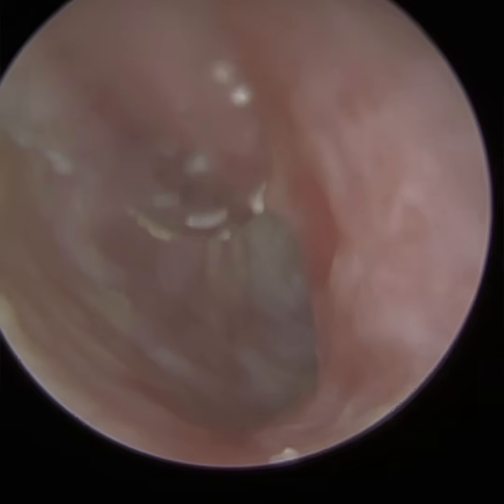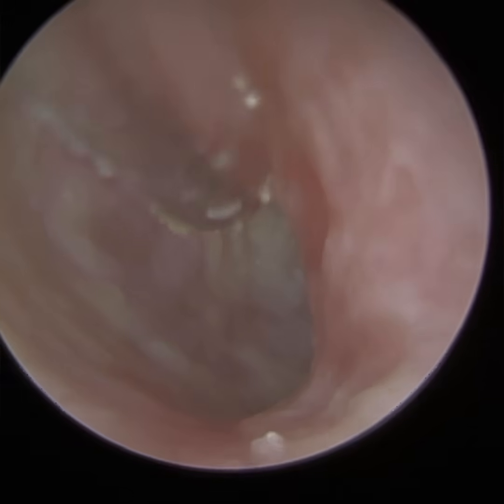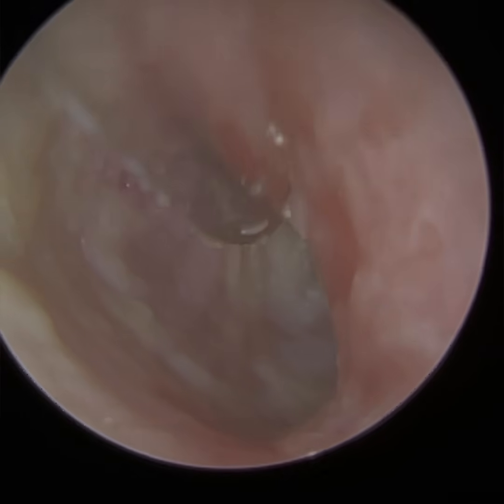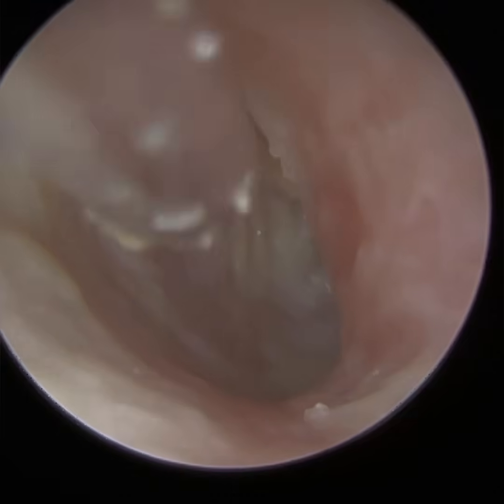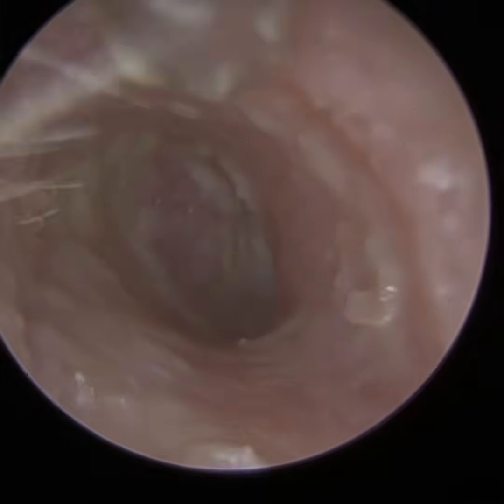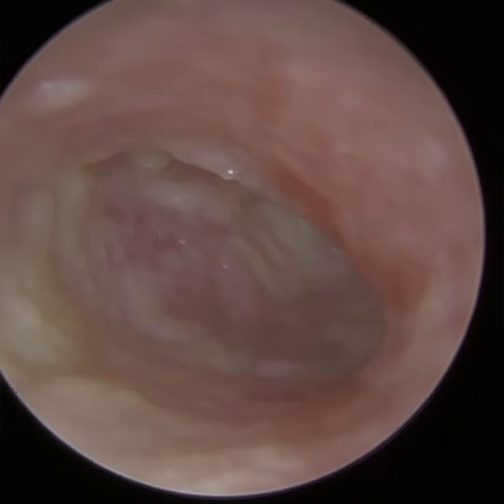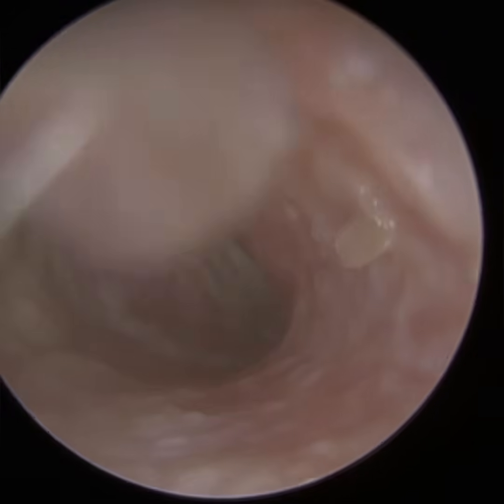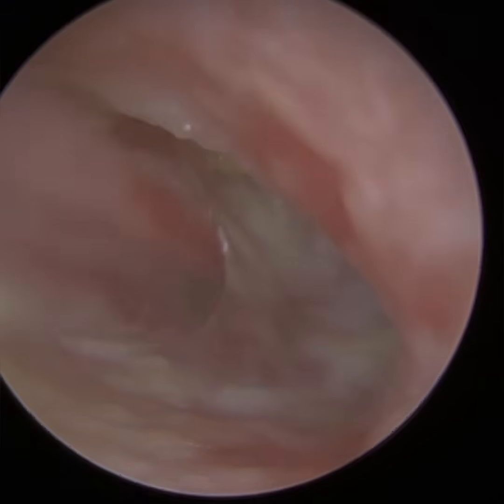It also consists of a middle layer made up of fibrous tissue, and the fibrous tissue is aligned in 2 ways, at least in terms of the pars tensa. So the pars tensa is the main body of the eardrum, and the top part of the eardrum, which hopefully I'll show you once I've cleared this debris, we call that the pars flaccida.